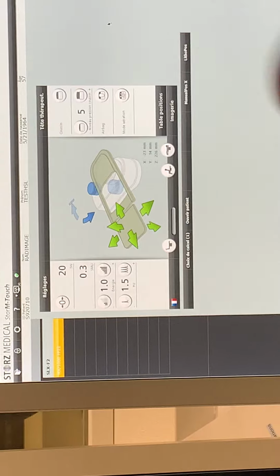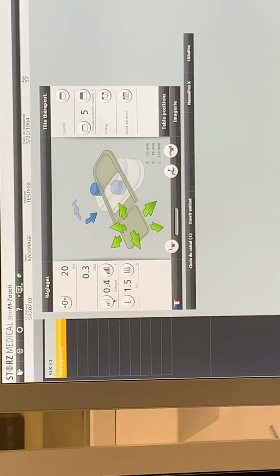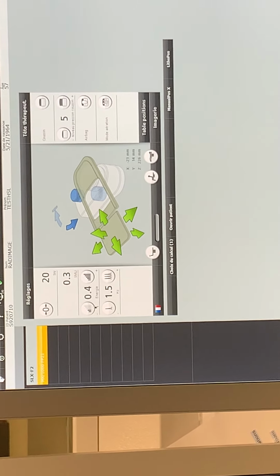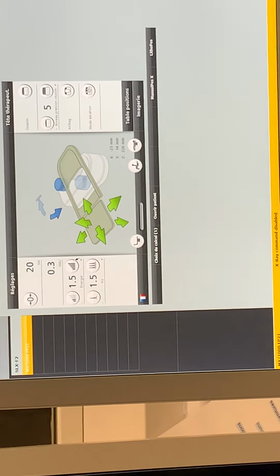X, Y, and Z. Water between patient and patient foil. Silicone oil on the therapy head. So we don't need to bring the head in, the head out, and that's all. This is what we are doing now. Before, after you ask the three questions, we can start with the treatment. This silicone oil is new. We didn't have that before.